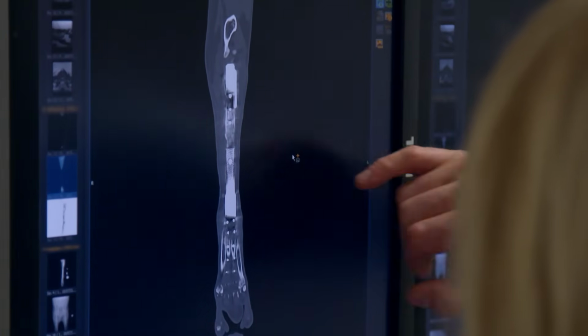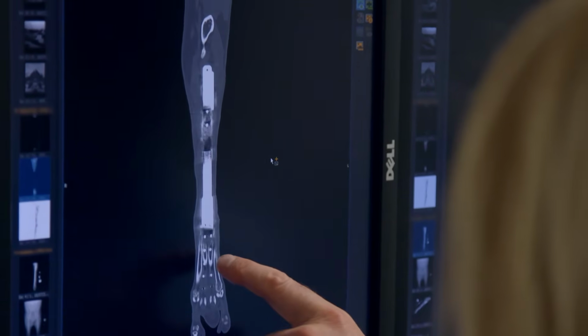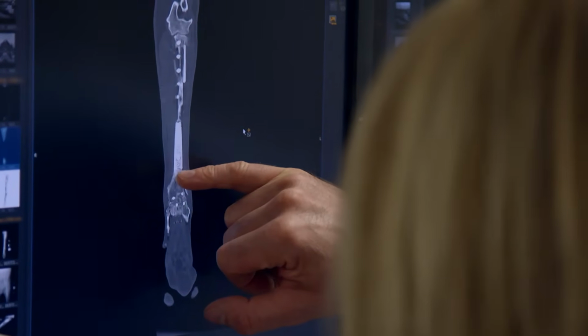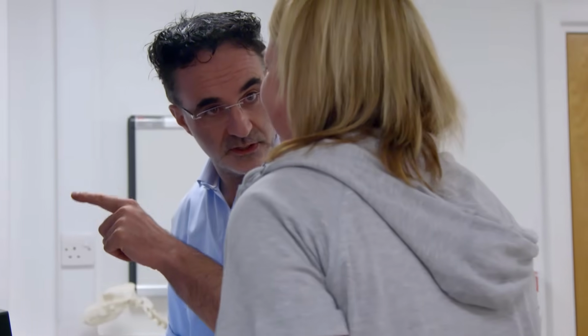Come. Okay, the leg's doing fine. So the implant has done what we asked it to do. And the bone has grown in quite well. In fact, very well. So that bone there is growing physically down onto the mesh. You see that? Yeah. And at the bottom, you can see the same thing. You see the bone growing up there? Yeah. And inside that honeycomb structure, you'll see specks of grey that look very like those specks of grey, and that's bone growing through the mesh. So that's done exactly what we've asked it to do. Nice one. Exactly, nice one. Yeah, no, that's good. That's good.